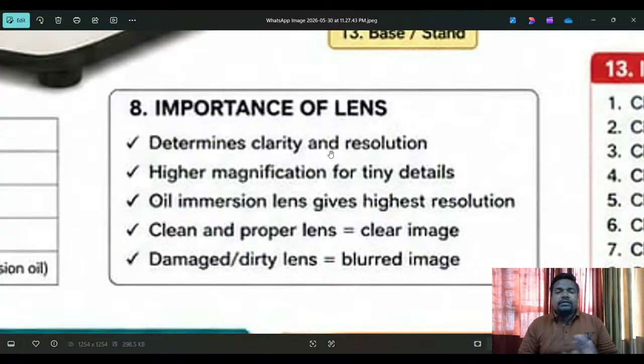This is all information for every biomedical engineer. If you are a senior biomedical engineer, these things are a minor issue: "I know, sir, I know, sir." But when you are at the starting stage, you have to practice. Even in the initial stage you have to keep it in mind and be patient, because in medical equipment, even with 10 years of experience, in the 11th year a new problem will come. That is medical equipment. So every time be patient, practice and focus on your career.